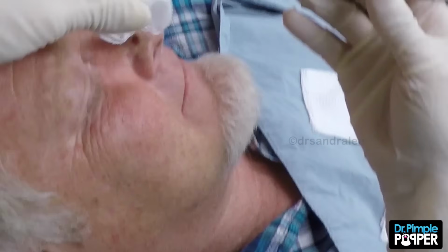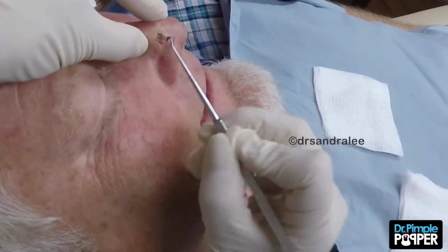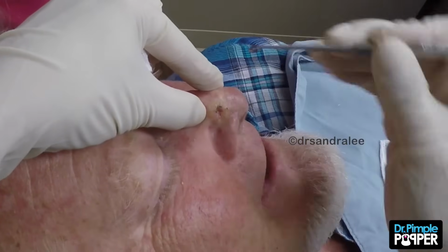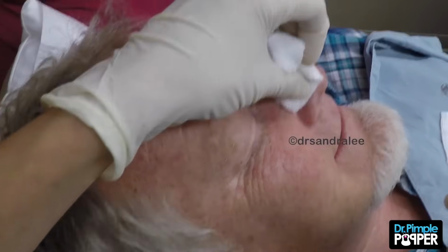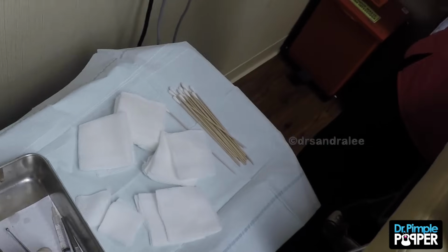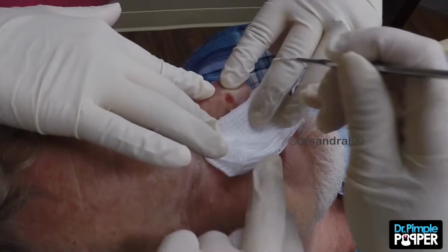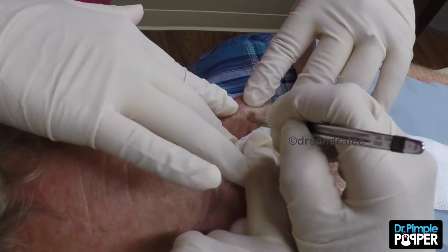Your head on. I'm going to scratch this just to make sure you're nice and numb first of all. Nice and numb, right? We're on camera. Pardon me. Yes, I feel nothing. Okay, good. Make sure you never feel anything sharp or uncomfortable. We're going to squeeze you here, so make sure you can breathe, like breathing through your mouth if you can't breathe through your nose. And make sure nothing's sharp or uncomfortable.